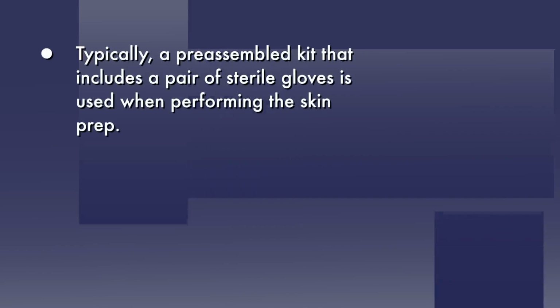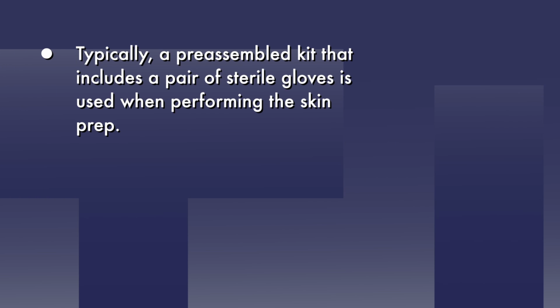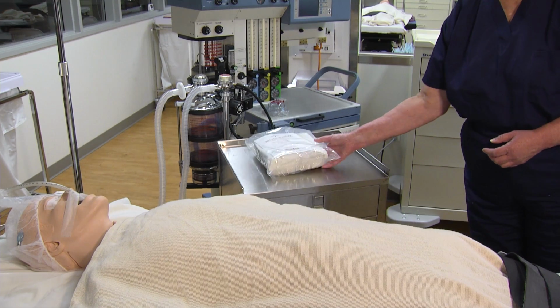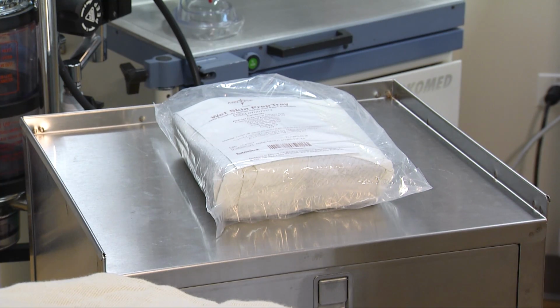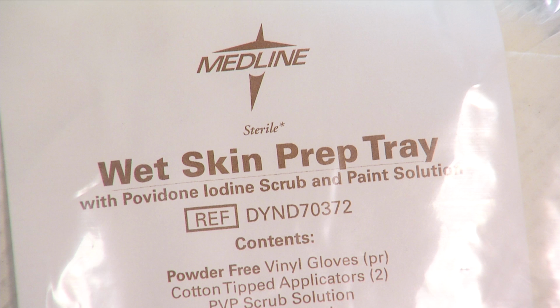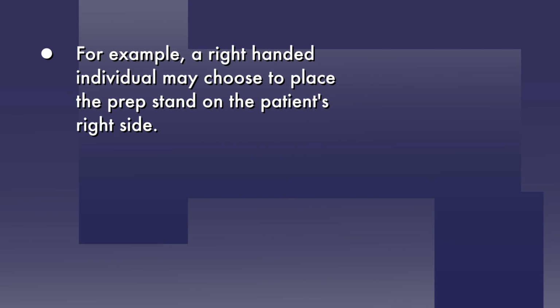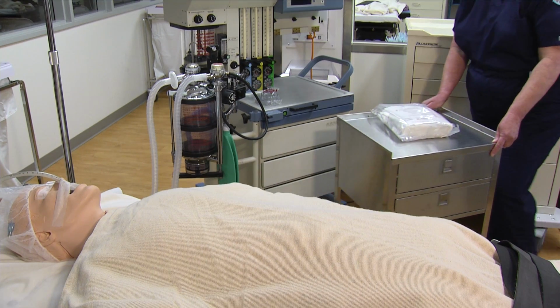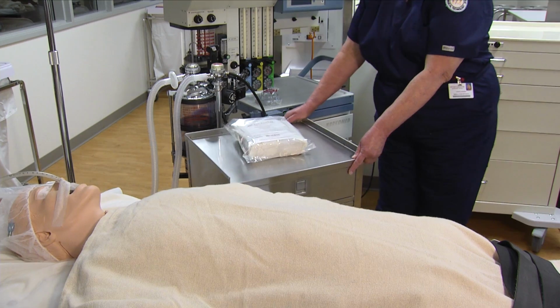Typically, a preassembled kit that includes a pair of sterile gloves is used when performing the skin prep. The kit is placed on a prep stand, which is positioned to allow the individual performing the procedure to use their dominant hand most effectively. For example, a right-handed individual may choose to place the prep stand on the patient's right side, while a left-handed individual may select the patient's left side.